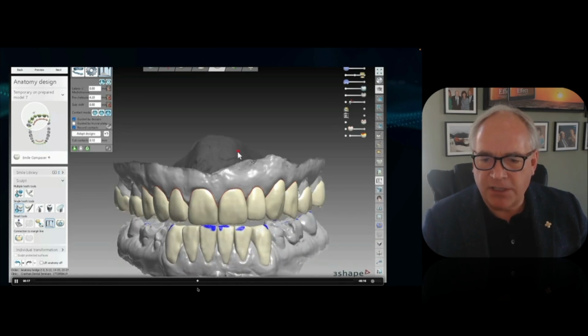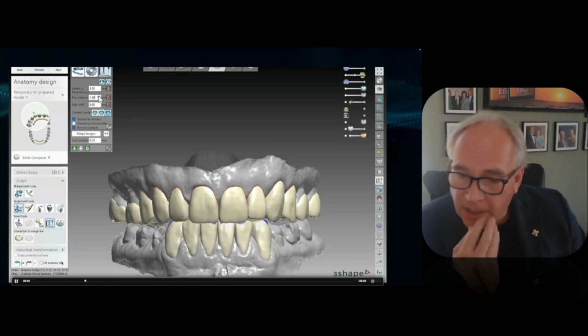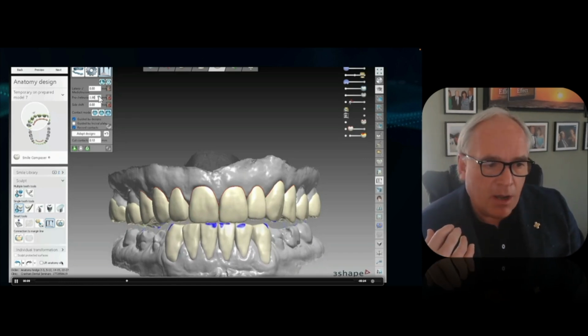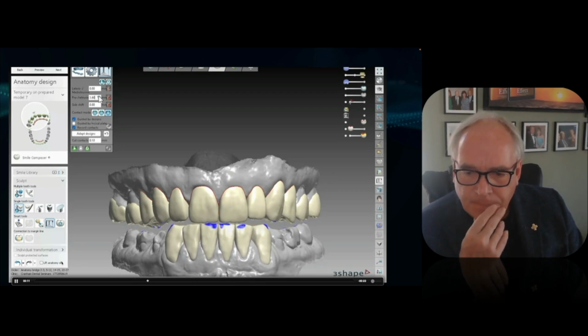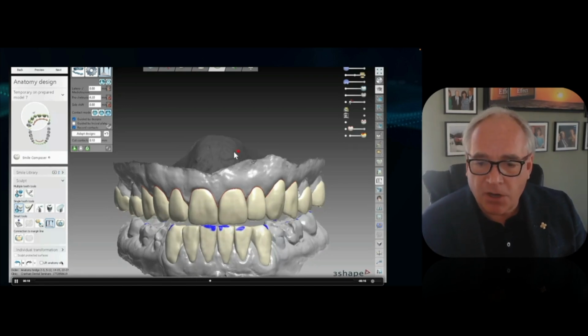These are the little nuanced things that when we design, whether we're going to print this to help us make a Lux temp print provisional, or if we are going to go ahead and utilize this file to print a provisional, those are all things that we can do.